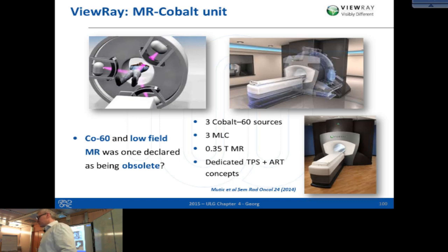Do you know the orientation of the magnetic field of the MRI? I can look at it, I mean, probably if you Google ViewRay. Well, you can't do that, then just communicate in the line of the patient, because otherwise. So I would assume, if these are the magnets, it's like this, in this direction. Is it the same direction? Yeah. It's right into the patient. Yeah. Excellent.